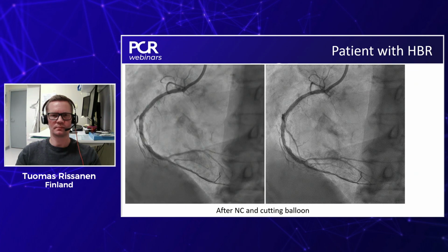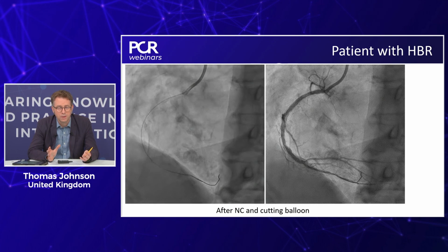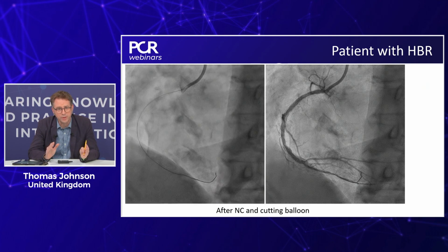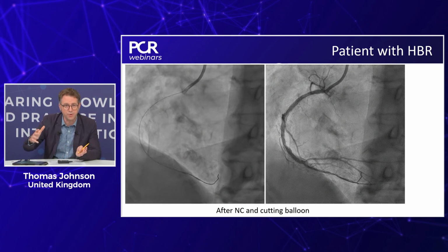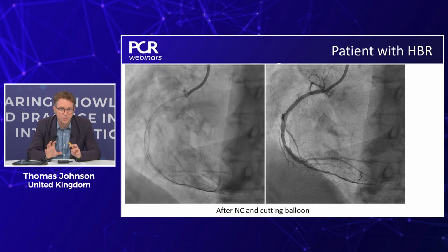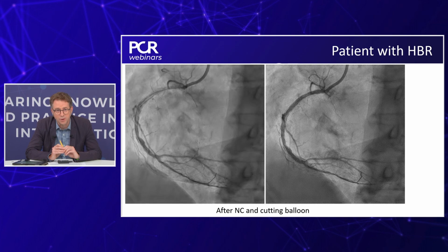Yeah, so I mean, there's a trade-off now, isn't there? As Gabor said, you've made a decision up front here that this is a high bleeding risk patient who you want to do everything to avoid lots of stent. So I guess the question is, do you place a stent in the area where you've got recoil? Or as Usha online's asking, can we assume that with the delivery of the drug, in time we'll see positive remodeling of those segments? So can we anticipate that we'll have a better result in 3 months than we have acutely? So it's a trade-off, and I think this becomes more challenging and nuanced in terms of patient-tailored delivery. But maybe show us what you've done here, Thomas, in the context of this patient.